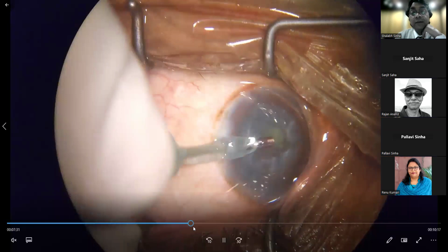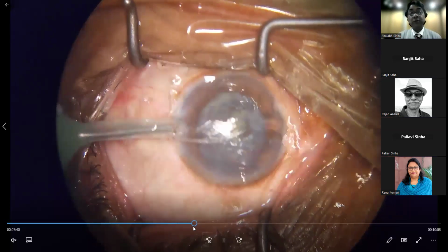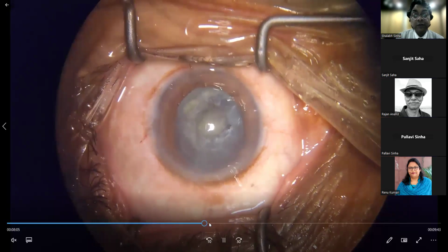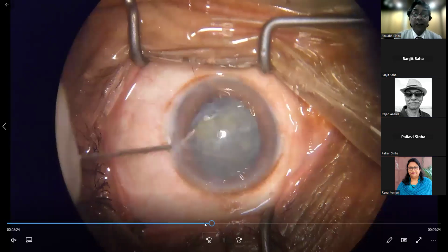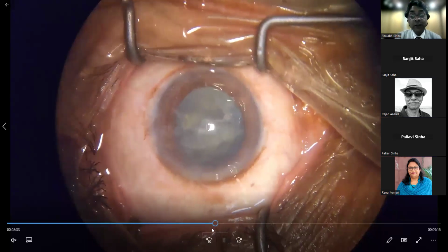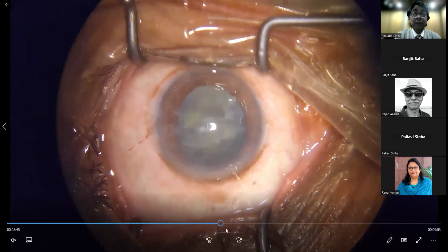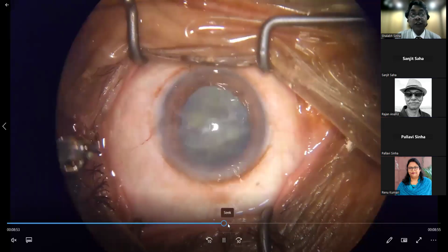So after the set has been changed, again gone inside to emulsify, but I think still there is a problem. So what I did now was that I used viscoelastic to go behind that fragment. Viscodissection. Rather than using fluid, I have decided to use viscoelastic, go behind, and help that nuclear fragment to come in the center, so that it becomes easier for me to remove the nucleus.